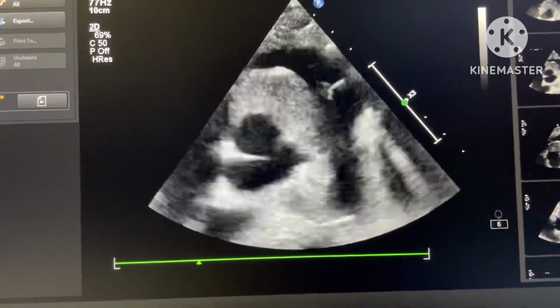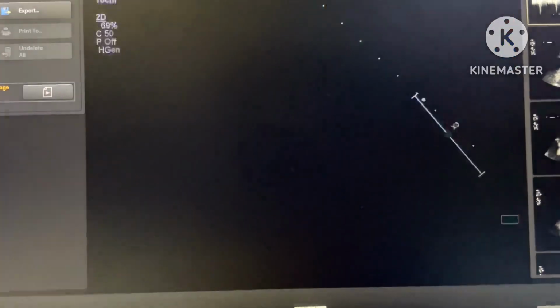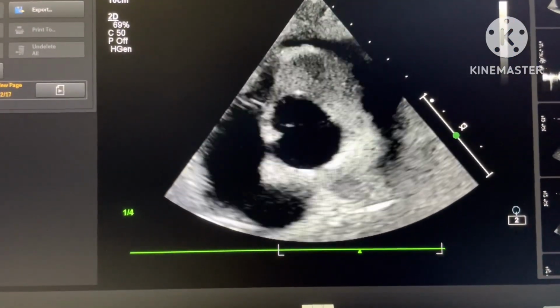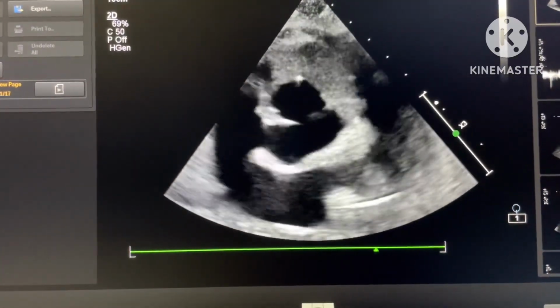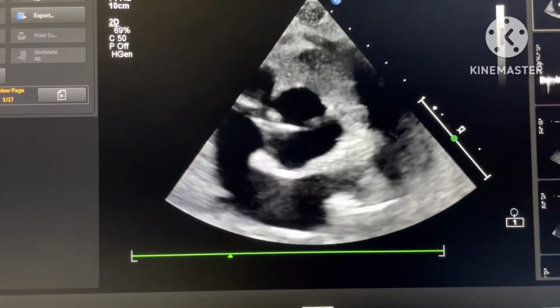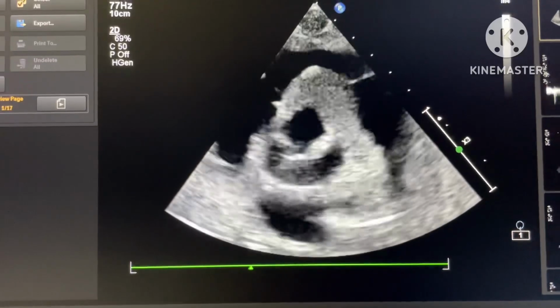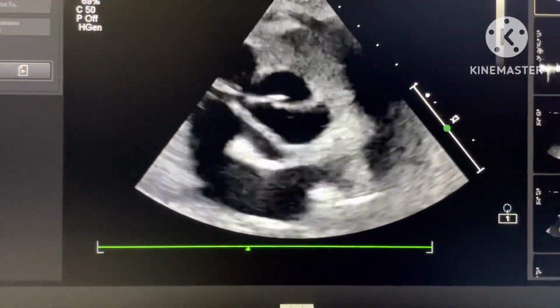In this case of bicuspid aortic valve, the patient is having septicemia-like features, low BP, nausea, vomiting, mildly raised serum creatinine, and mildly raised SGPT. So this is a case of aortic root abscess in a case of bicuspid aortic valve. That is the finding. Thank you.